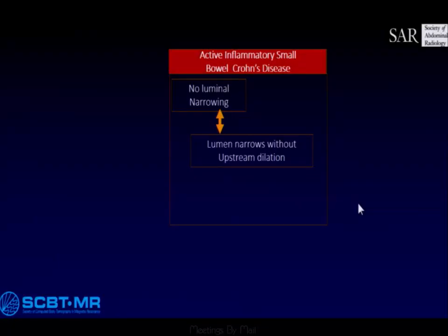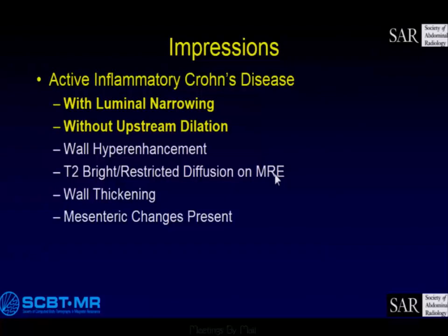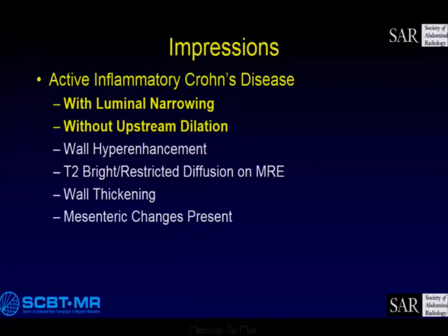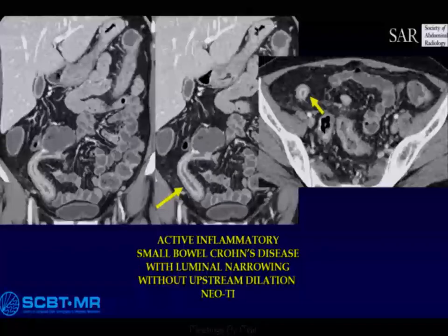What happens when things progress? The lumen narrows, but there's no upstream dilation. So again: luminal narrowing, no upstream dilation, hyperenhancement, T2 bright, restricted diffusion, wall thickening, and mesenteric changes.